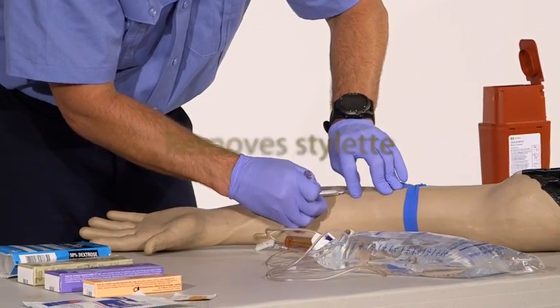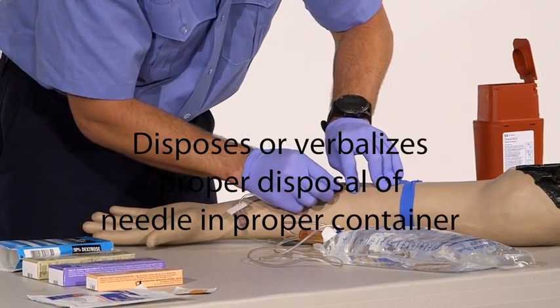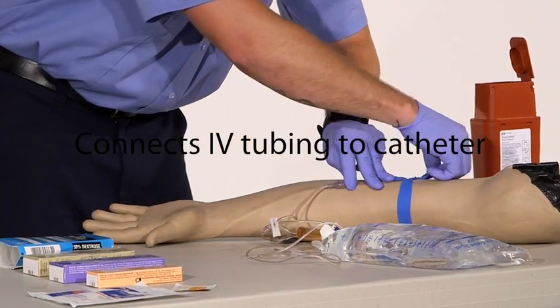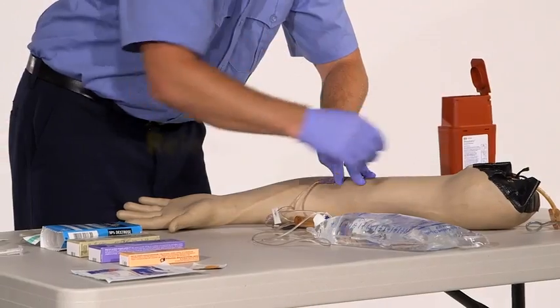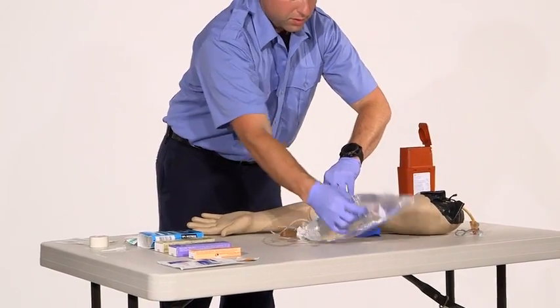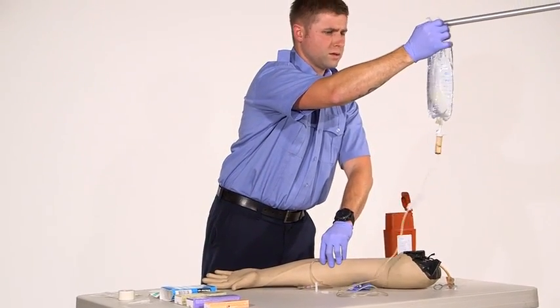Remove needle, place it into the sharps container, and get the drip set secured on there. Once that's on, remove the tourniquet, keep that secured, and place my drip set.